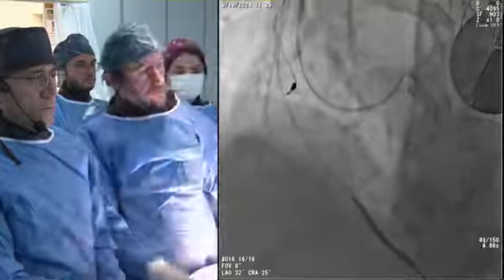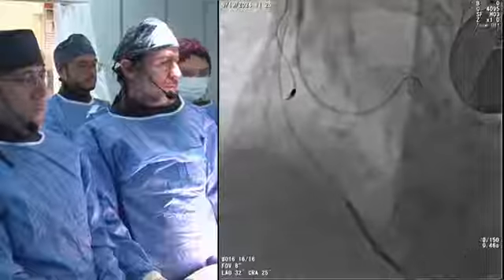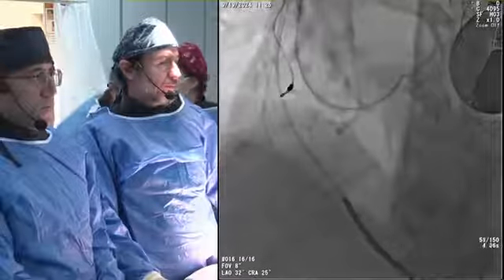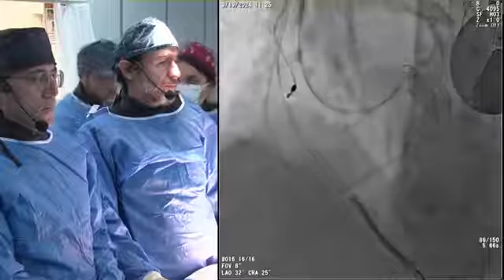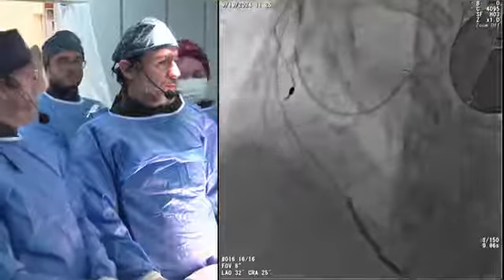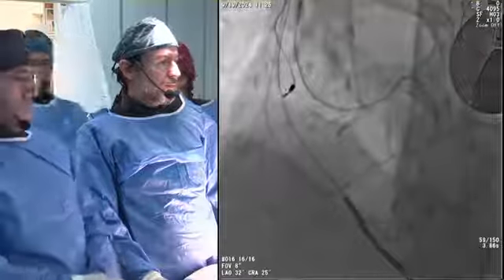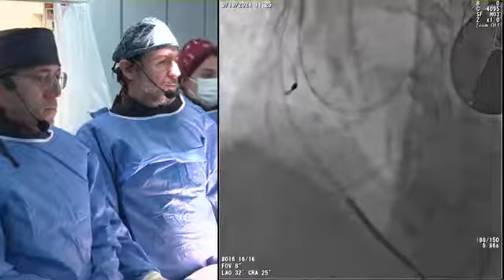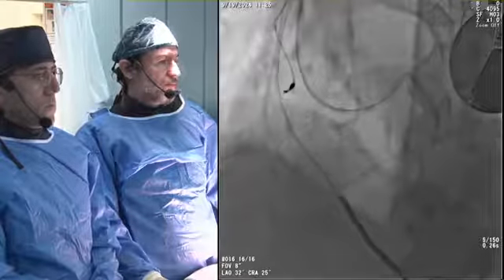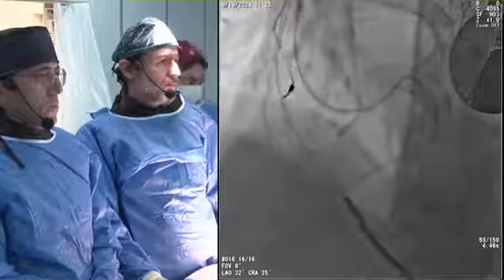So in terms of 6 French, 7 French, regardless, some kind of push for the reverse CART necessitates the integrated retrograde wiring. And I believe that the femoral approach would provide the best antegrade approach for the ostium. That is one possible advice for me, but I don't know how you take it. Radial always provides very poor and unsteady support.